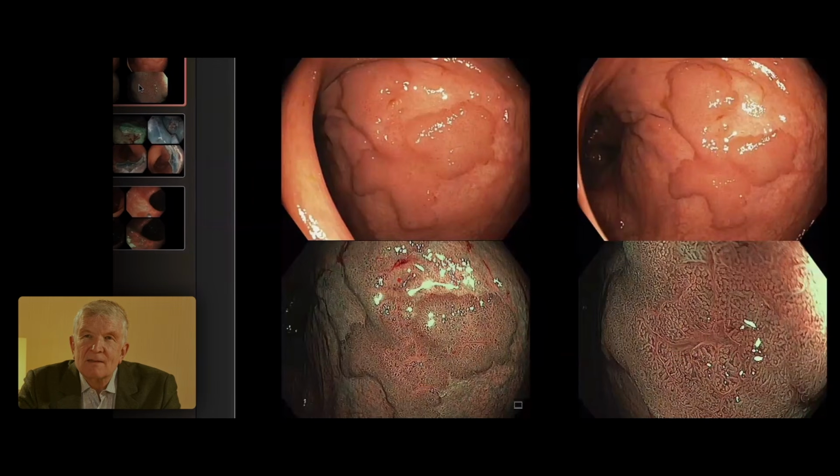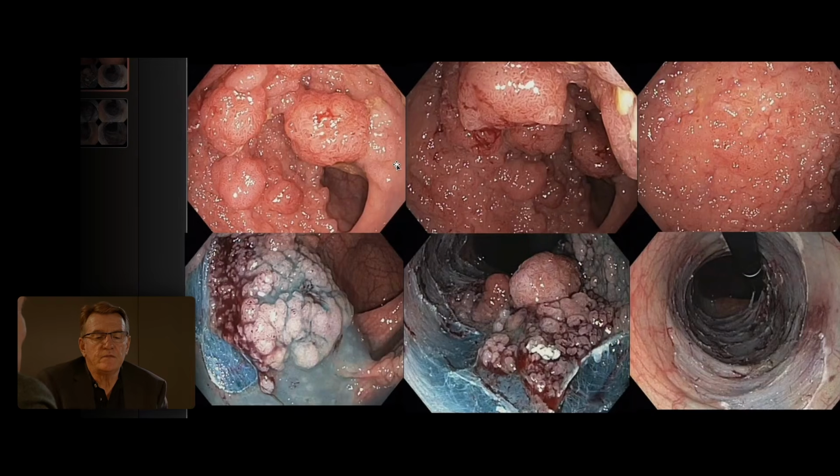So, Michael, next example: difficult lesions looking ugly. Yeah, this is a challenging lesion to evaluate. If you look up here at the top right, there's a little bit of mucus here, so that should have been cleaned a bit better. But overall, we can see that this is a granular lesion with a homogeneous pattern, nothing to be worried about. And then when we move away from that area, over here, we can see that there are a number of nodules. This lesion's in the proximal colon.